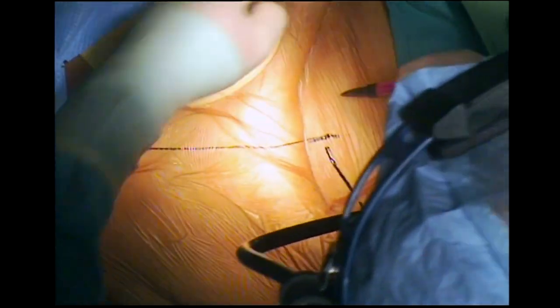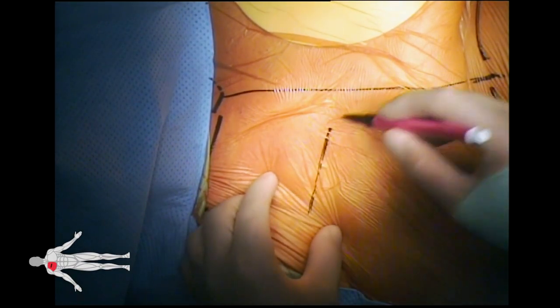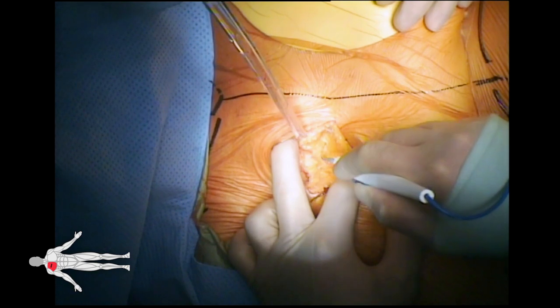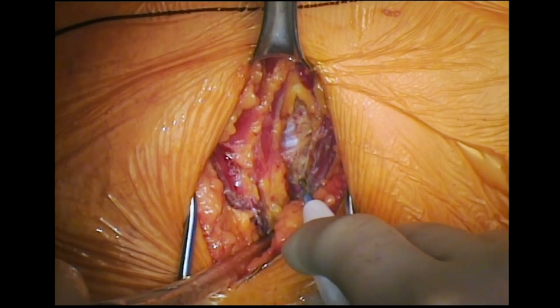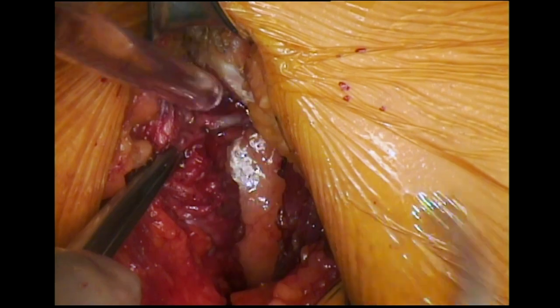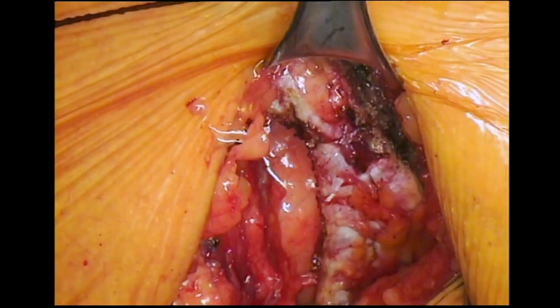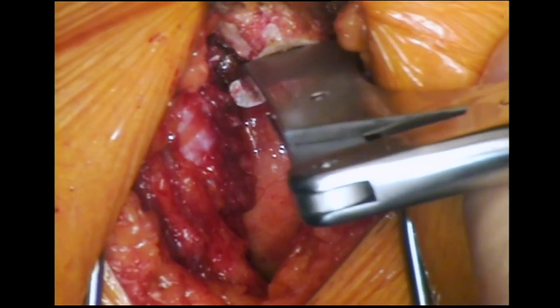The patient is positioned supine with a horizontal shoulder roll. The chest is entered via the second intercostal space anteriorly. The right internal mammary artery is clipped and divided above and below the third rib. The third rib is now transected close to its attachment to the sternum.